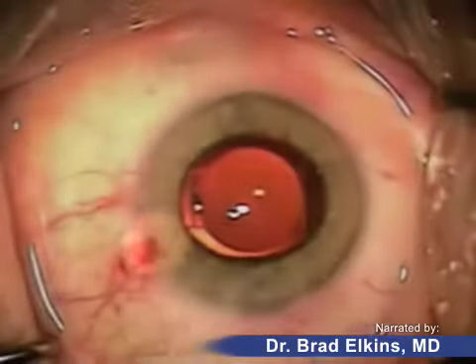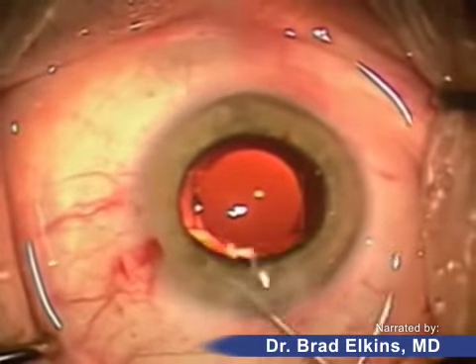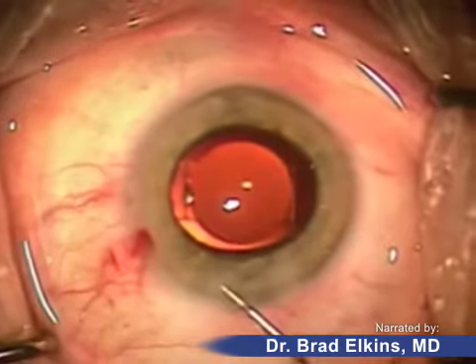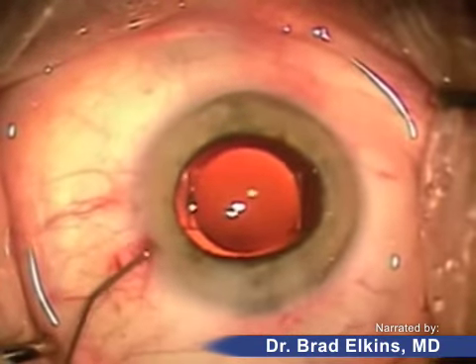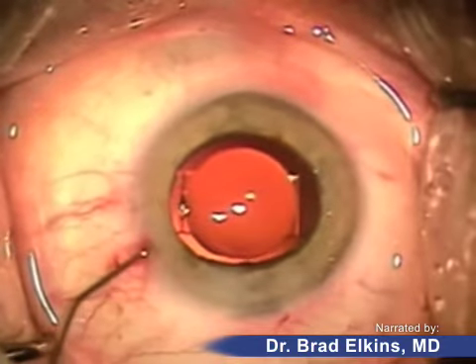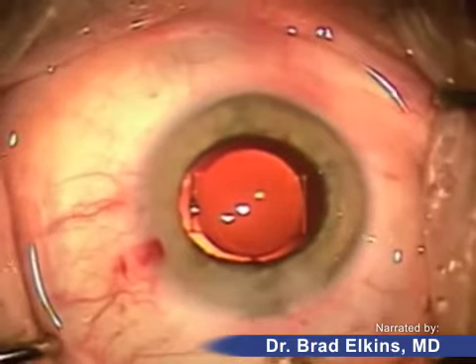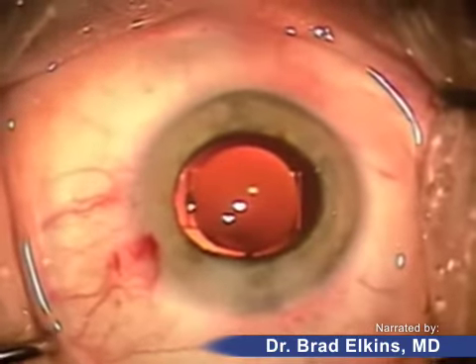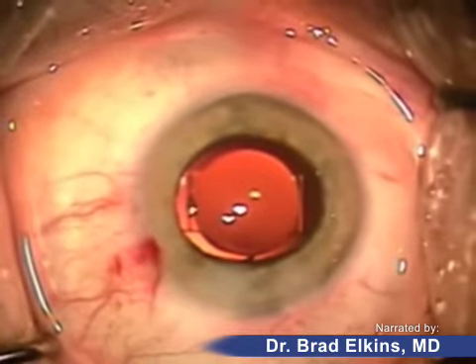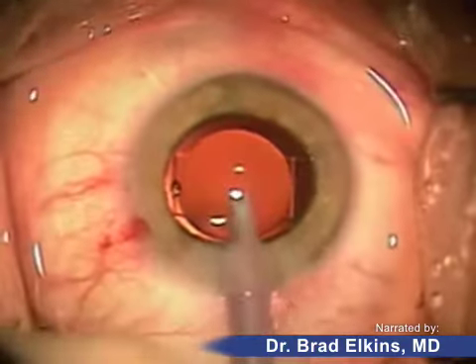The wound is being hydrated here and here with a little bit of fluid. This fluid creates a watertight structure which prevents any leakage from the eye. No stitches are needed in this type of surgery because of the diamond knives, the small incision, as well as the modern surgical techniques being used. The eye will be checked for leaks — I push on the eye with my finger and other instruments to make sure that fluid is not going to leak.